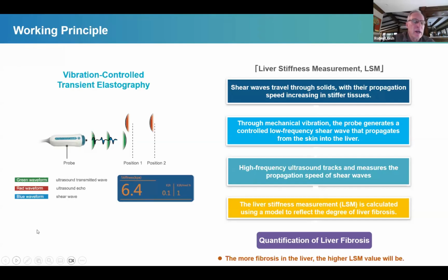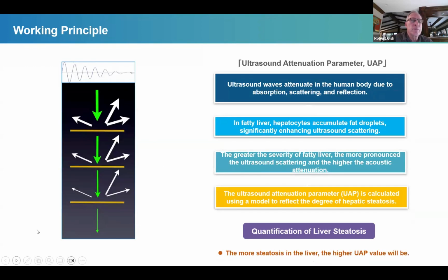This is the vital sign of the liver. You're going to get blood pressure, pulse, respiratory rate, temperature on all of your patients in clinic. And now, if you have a liver patient, determining liver stiffness and also attenuation scores, which I'll add in as the second main tool on these devices to calculate the fat level in a patient through an attenuation number specifically.